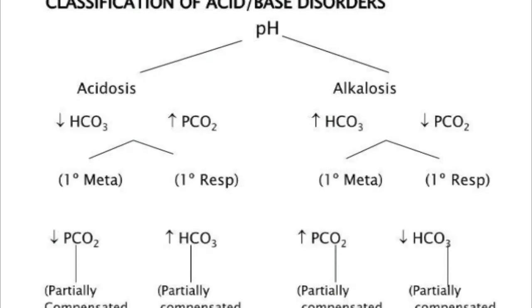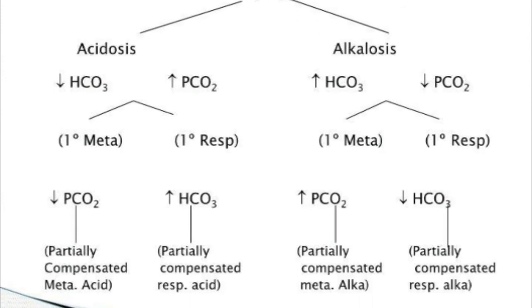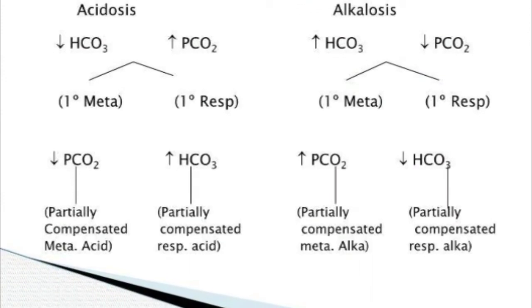we have a case study: patient in ER experiences shortness of breath, high blood pressure, decreased level of consciousness, so like coming in and out, and blood gas results were as follows. So pH 7.16, that's a low pH. We're going to go down on the acid side. PCO2 is 115, and that is very high. Okay, so that's very acidic.